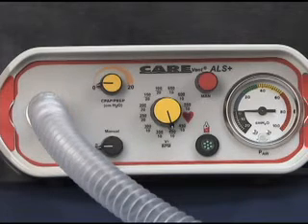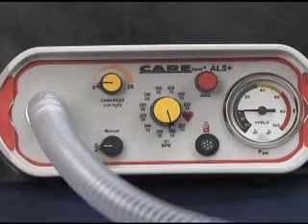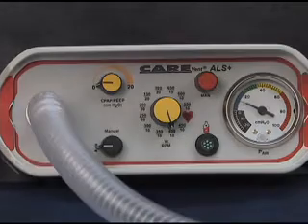rate and volume. In order to initiate demand flow in the mask ventilated patient, the operator must obtain a positive mask-to-face seal. The automatic cycling will restart if the patient's demand flow drops below 30 liters per minute for greater than 4 seconds. This takes place without any intervention on the part of the operator. Automatic cycling restarts will typically take between 4 and 7 seconds, depending on the depth of the patient's respirations.